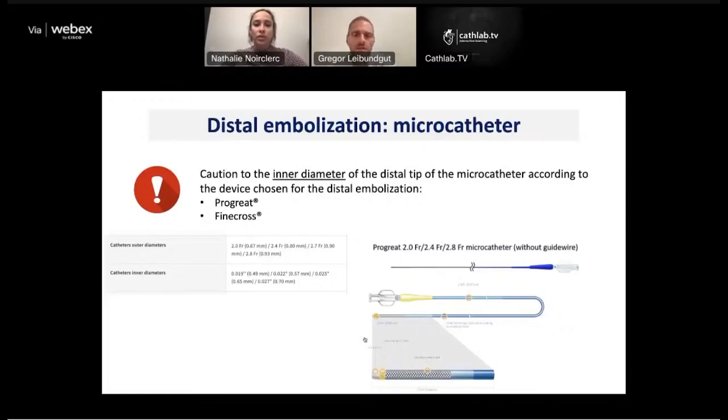I think excellent point, Natalie. This is absolutely crucial. The best coils do not help you if you cannot bring them to the perforation site, and you cannot do it with any of the regular interventional catheters like the Asahi Corsair family, the Turnpikes from Teleflex, you name it.